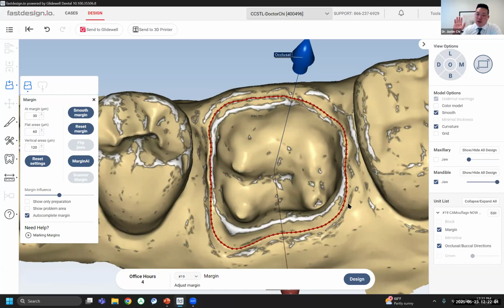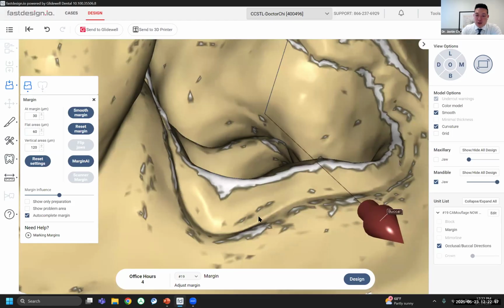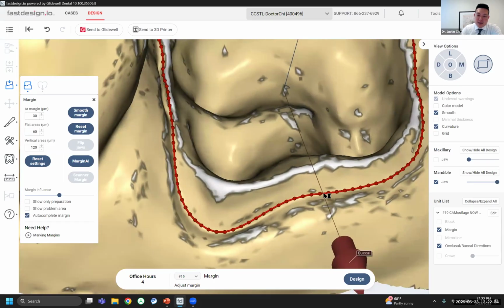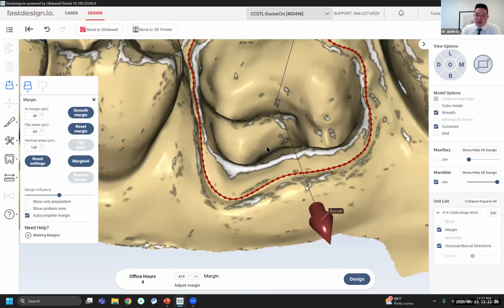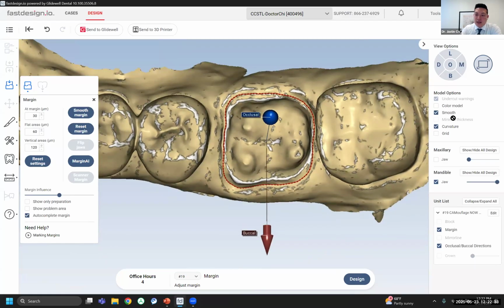That's the transition point from the coronal tooth structure outside, and that transition into the root canal space. So I'm going to keep the margins where we are. You can see when there's not super great retraction and a super sharp finish line, it doesn't highlight it very, very clearly. But here I have the margin just a little bit past. I can see where the tooth structure meets the soft tissue, and that really is a very good indicator. Okay, so that is the margin.